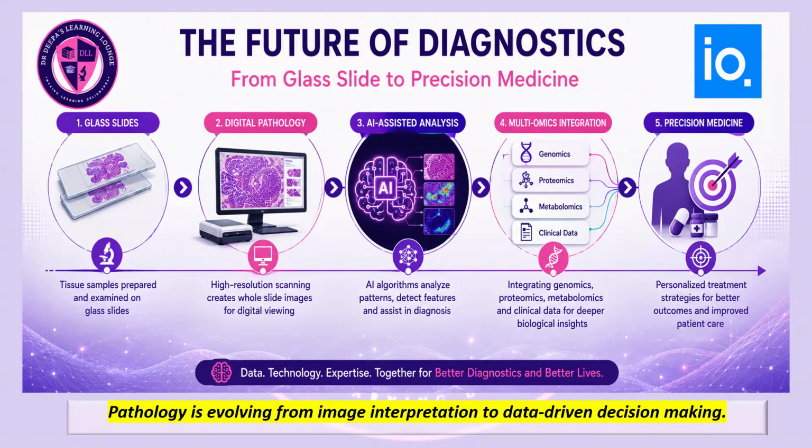For more than a century, pathology relied on examination of glass slides. That is something we've done over the years. I still love to look at my slides under the microscope, and the traditional approach remains the cornerstone for diagnosis, and continues to be indispensable too. However, it has some inherent limitations. One thing is, a glass slide can only be used at one location at one point of time. Let's assume I have a patient here. I will tell you my experience.